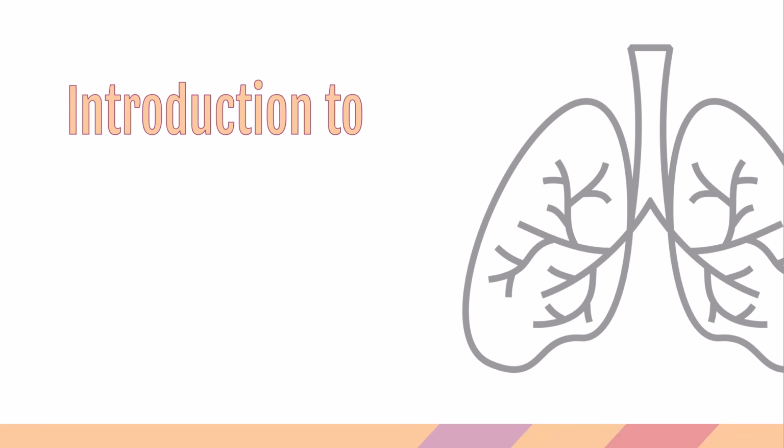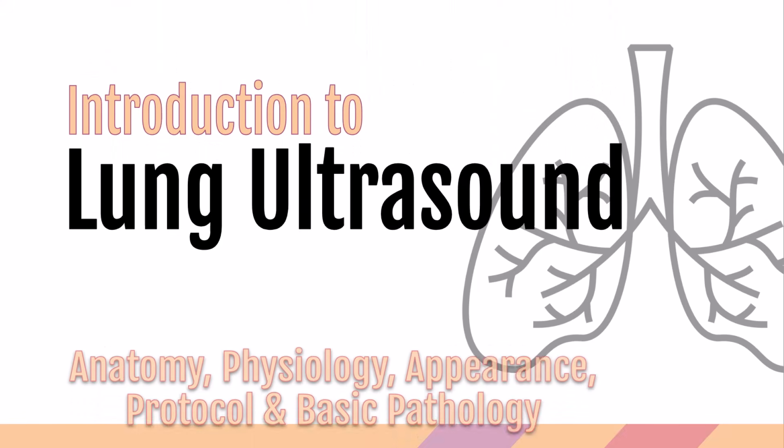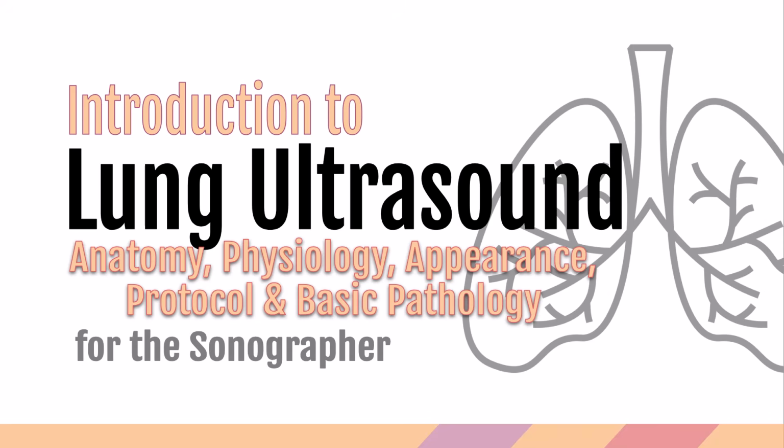Hi learners, it's Molly from Sound Nerds, and this short video is going to be a brief introduction to lung ultrasound for the general sonographer and the general sonography student. We'll take a look at anatomy, physiology, appearance, protocol, and basic pathology.